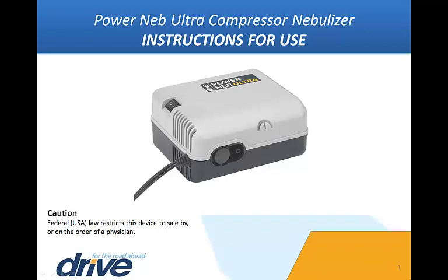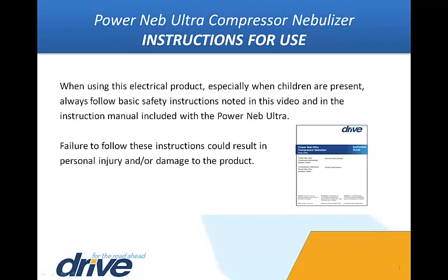This video will illustrate how to operate the nebulizer, as well as clean and assemble all of the parts correctly for maximum usage and benefits. When using this electrical product, especially when children are present, always follow basic safety instructions noted in this video and in the instruction manual included with the PowerNeb Ultra.